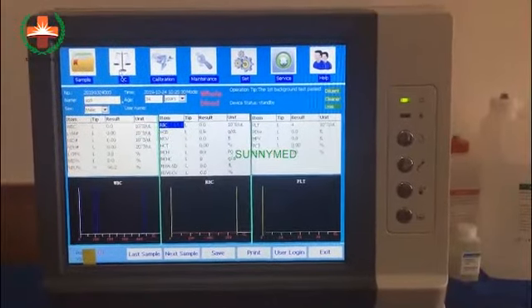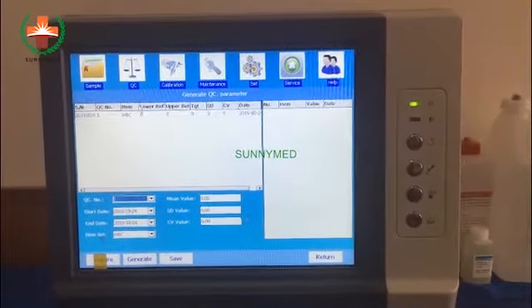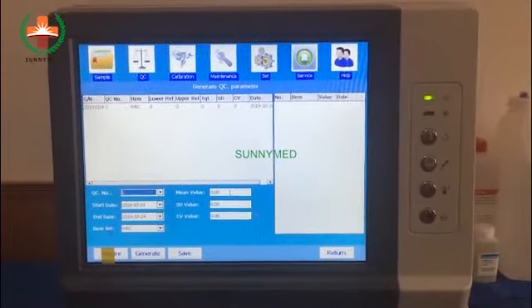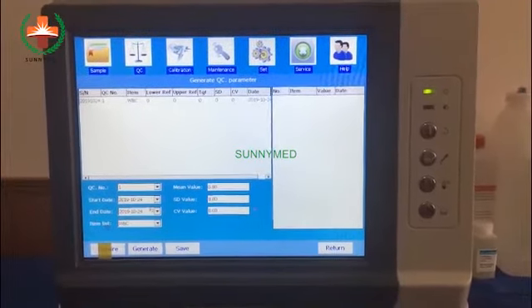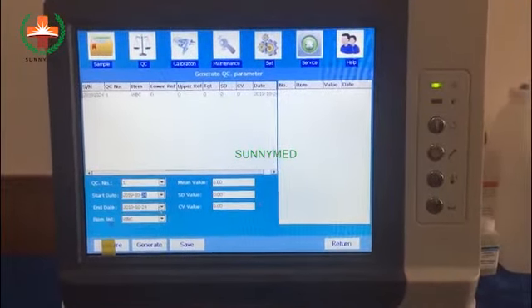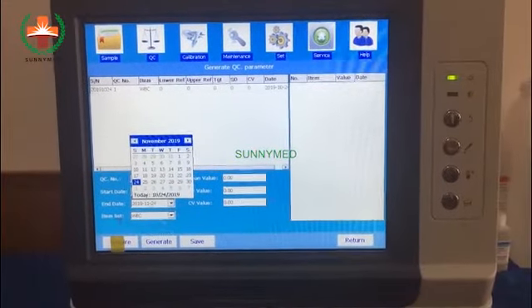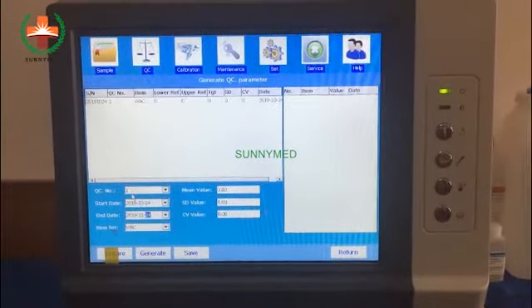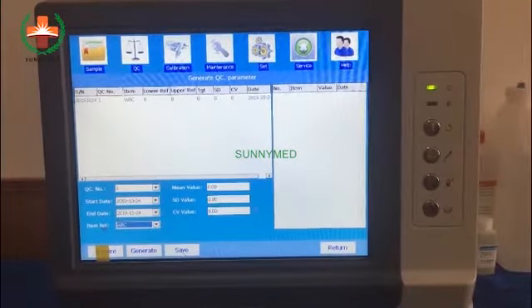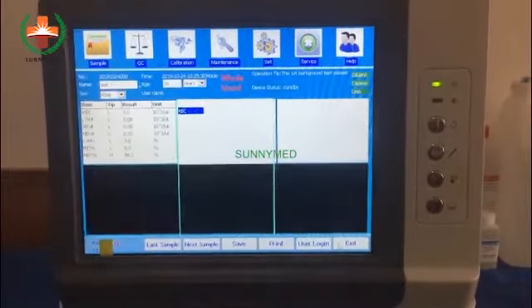Next, we click the QC parameter. Input the QC number, main values, start date. Usually we do the QC for 1 month. And test item. Then click Save. Click Return.